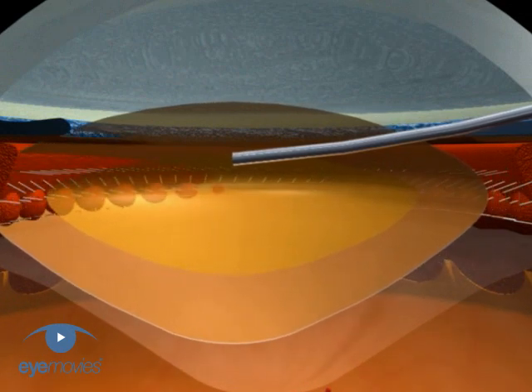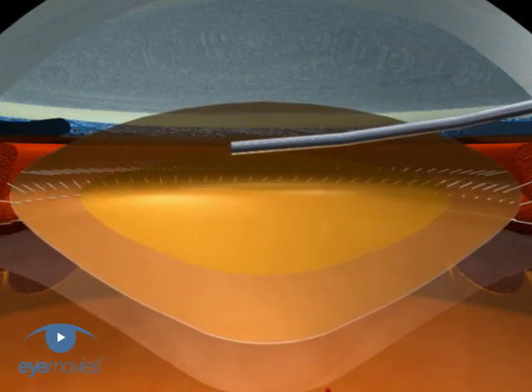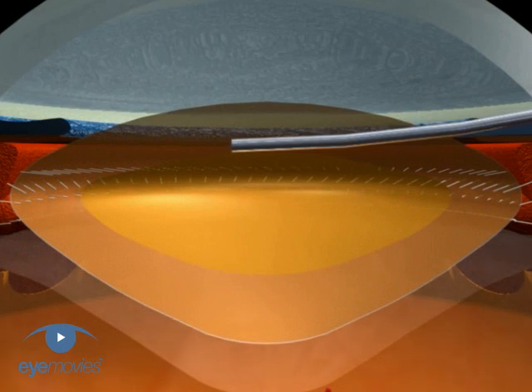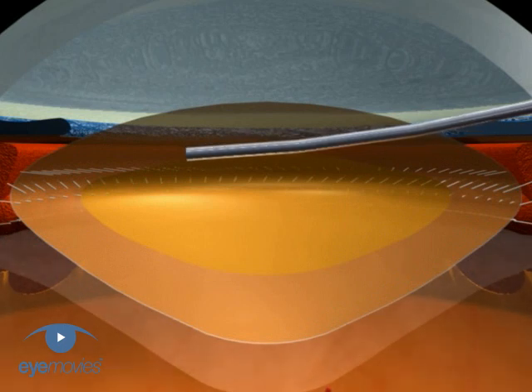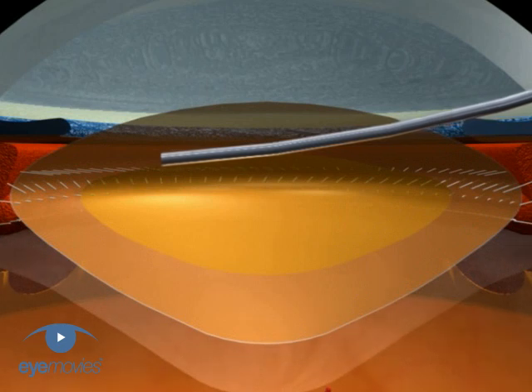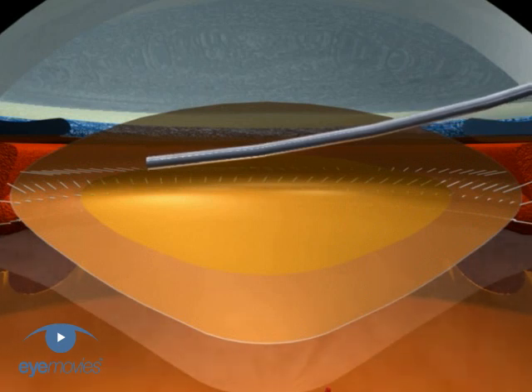You'll feel increasing resistance until it won't go in any further and the whole lens will start to move with the cannula. At this point, tilt the cannula more tangentially and slide it a little further out over the surface of the endonucleus.